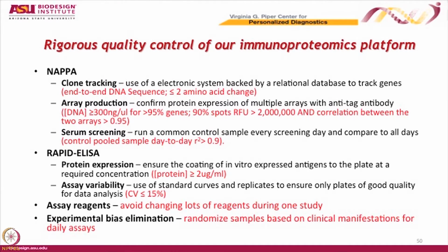And there are subtle variations to this. Maybe you do everything the same day, but you load the cases first, and then you load the controls second. And so the first ones that run through the machine are the cases, and then the next ones that run through the machine are the controls. So you have to make a concerted effort to mix up everything, so that there's an even distribution of cases and controls in every step you do, and that there is no order bias or plate bias or day bias to the cases or controls, or else you will end up chasing your tail.